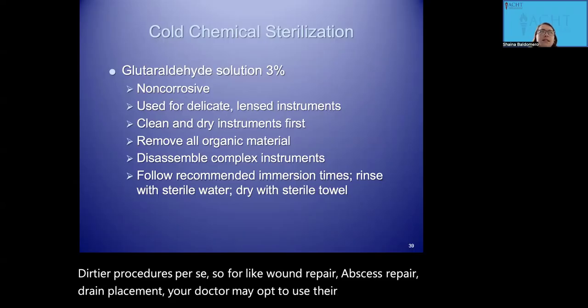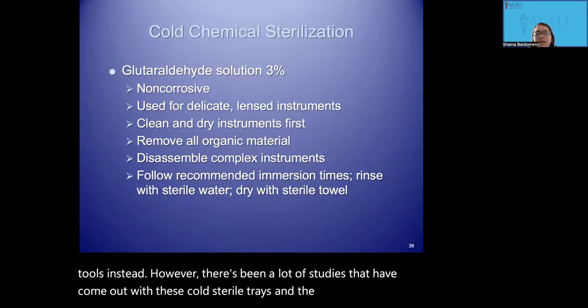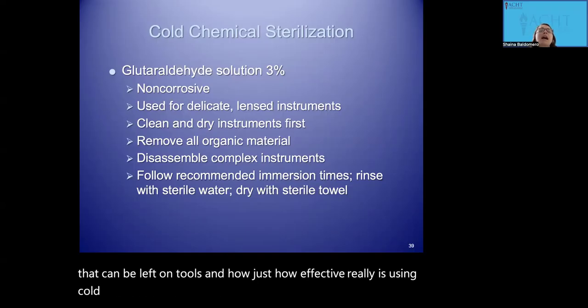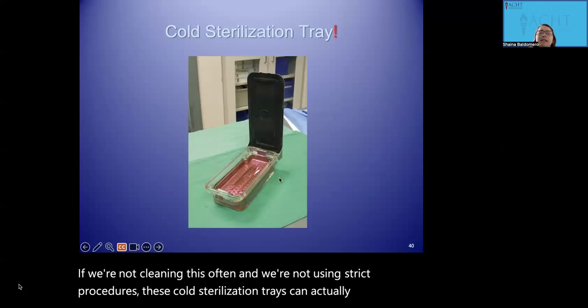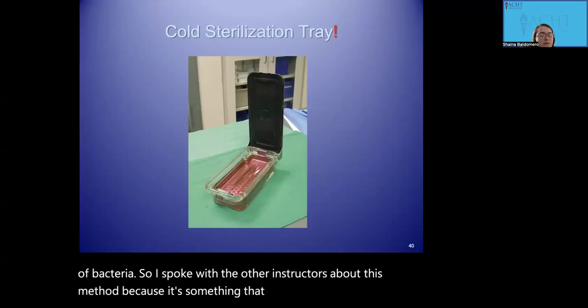your doctor might opt to use their cold sterile tools instead. However, there's been a lot of studies that have come out with these cold sterile trays and the organic material that can be left on tools and how effective really is using cold sterile. If we're not cleaning this often and we're not using strict procedures, these cold sterilization trays can actually harbor a lot of bacteria.